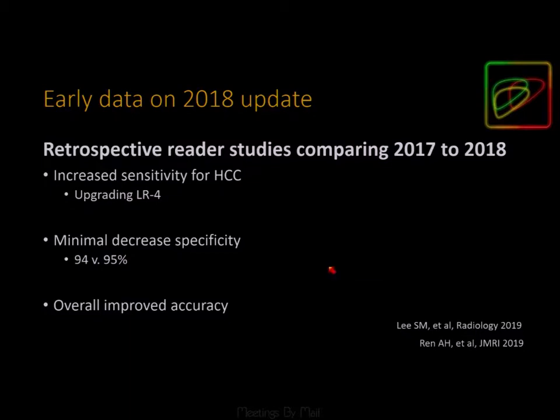This has resulted in a minimal decrease in specificity, which does not appear, at least in the papers out there today, to be significant clinically. And we have overall improved accuracy, especially for small HCCs.